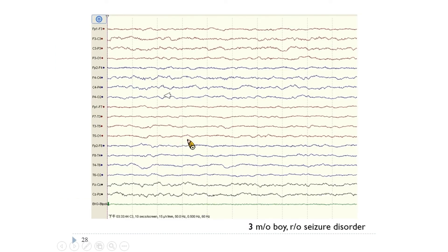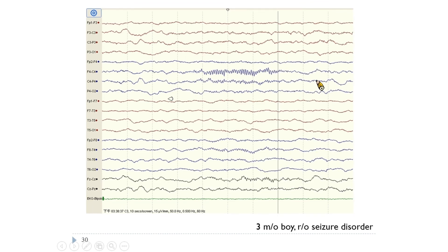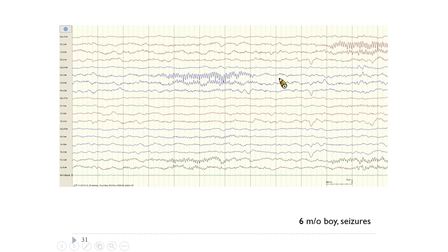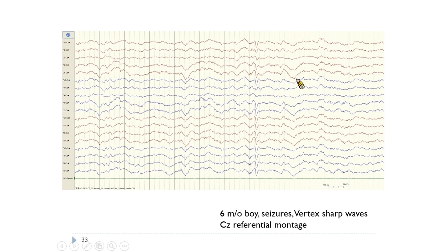A three-month-old boy referred to rule out seizure disorder. A sleep EEG without movement artifacts — you can see sleep spindles here, which can be asynchronous at this age. A six-month-old boy's sleep EEG also shows asynchronous sleep spindles; sleep spindles can be asynchronous until age 18 months. In the same boy, onset of vertex sharp waves is visible. On a Cz-referential montage, most electrodes are positive to Cz, so they show downward deflections.